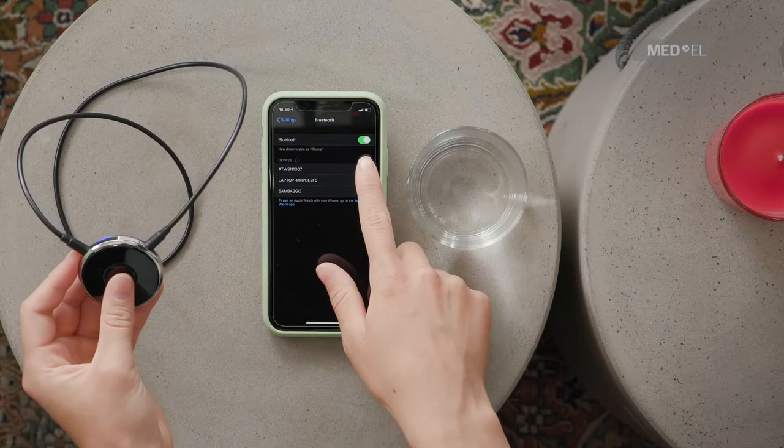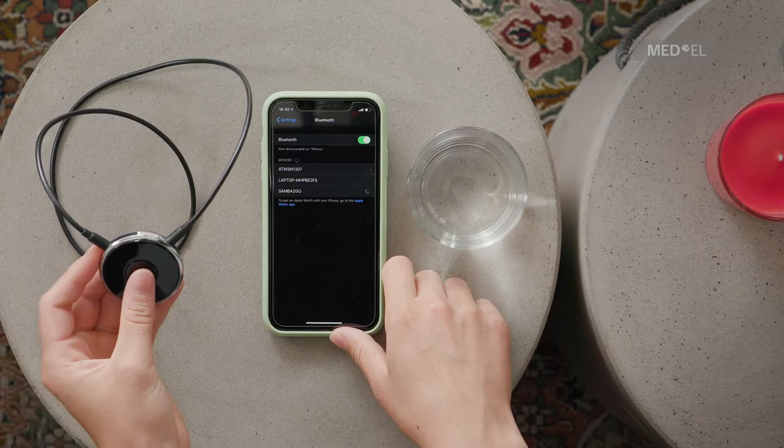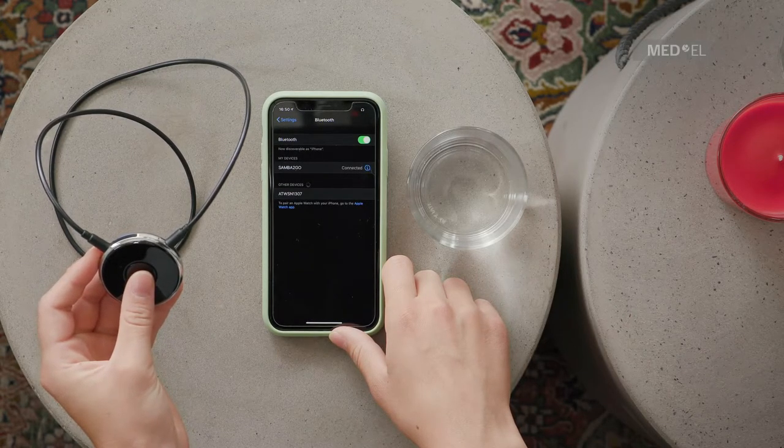Make sure Bluetooth is activated on your device. Search for other Bluetooth devices and select Samba2Go. If requested, enter the PIN 0000.